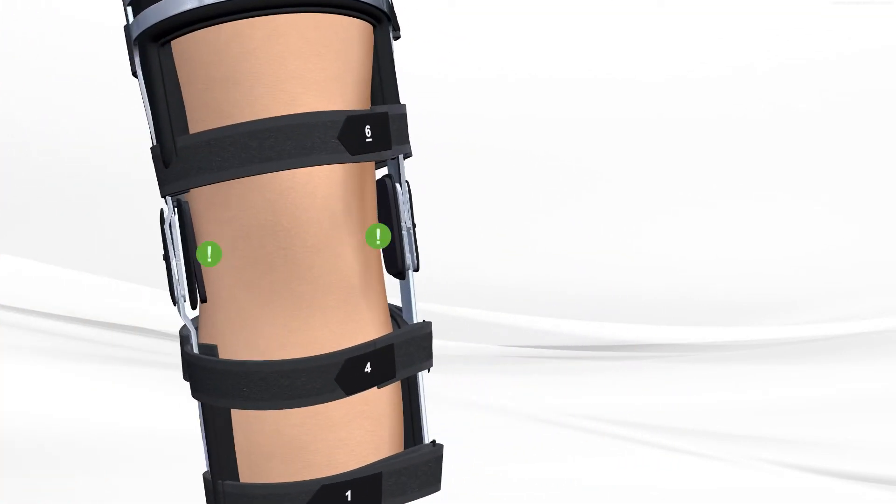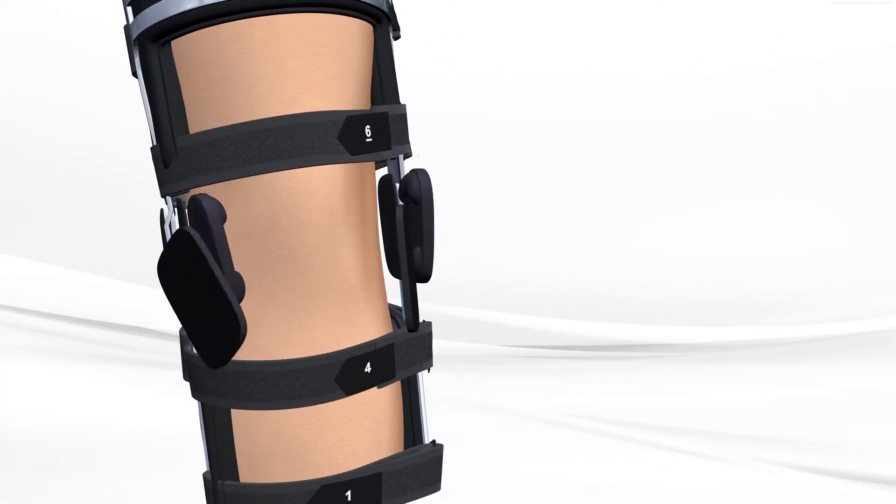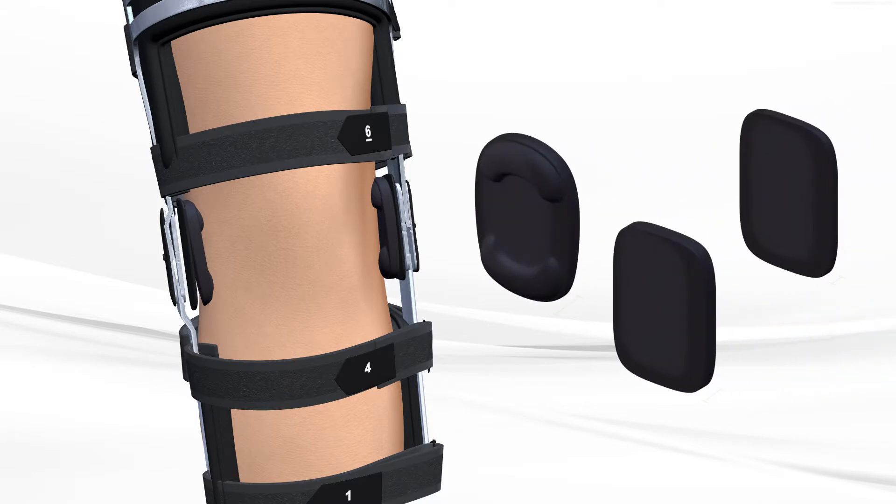Finally, if the brace seems too wide at the knee, replace the condylar pads. Each brace comes with three different pad thicknesses to ensure a tight and correct fit.